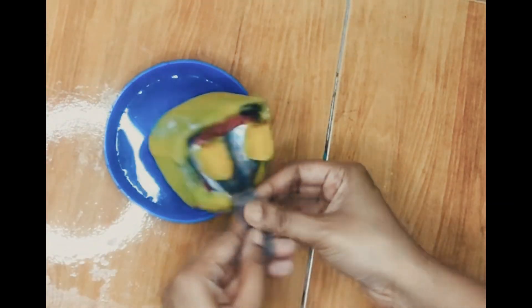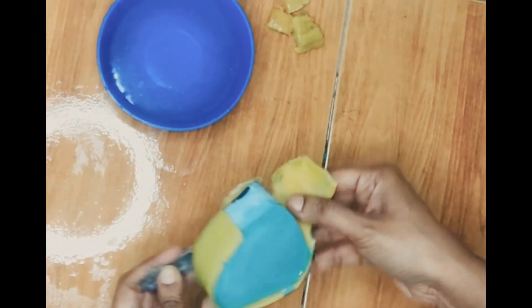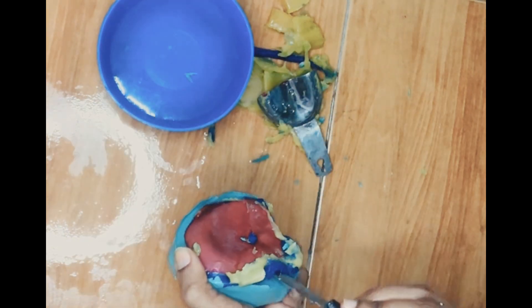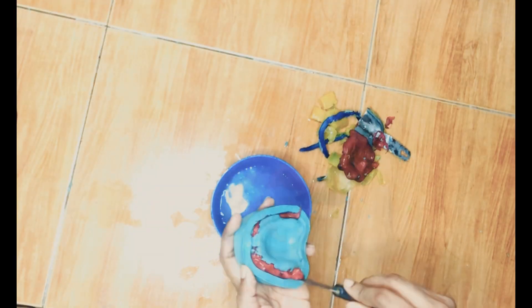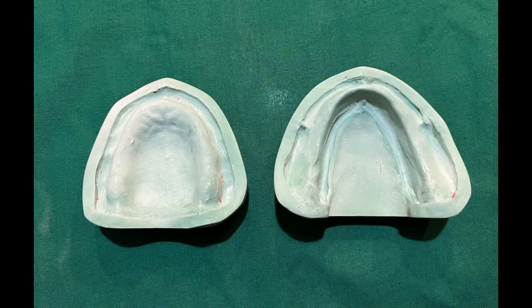To remove the cast, place it in a warm water bath, allow the material to soften, and carefully separate it by prying at the edges. Paying attention to these tiny details ensures that you get a dense and strong dental cast, which is a prerequisite for all upcoming clinical and laboratory procedures.